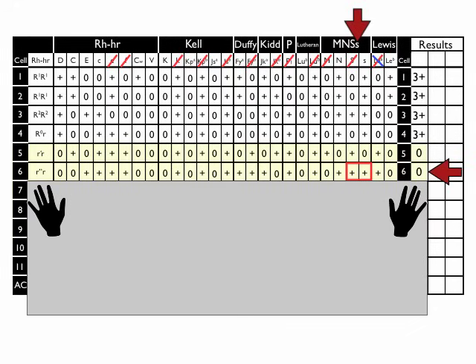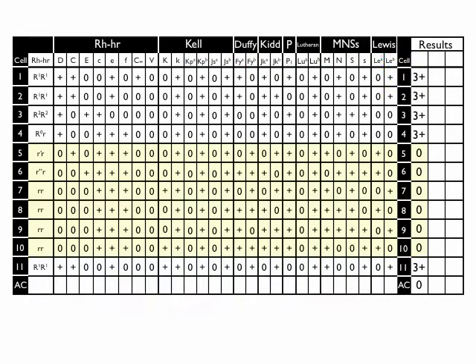Again, here we have single doses of both big S and little s, so you would not do any rule outs or any cross outs on either one. Then move on to M and N as the next pair. Here we have an assumed double dose of N, and we put a single slash through N, and guess what happens? We move along and we do the same thing all the way down the panel, looking at each and every cell. That works great. And honestly, you do that and you'll be golden. You won't have any problems whatsoever.